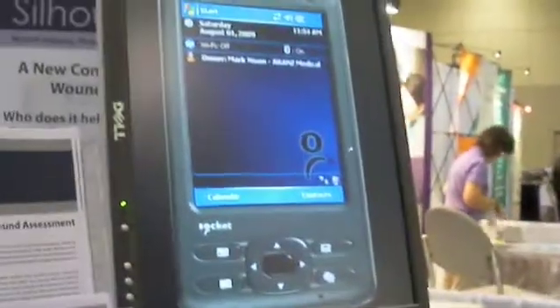Hello, my name is Mark and I'm going to demonstrate to you the Silhouette Mobile. Silhouette Mobile is a wound imaging and documentation system which creates a 3D model, allowing us to make accurate area and depth measurements. It is based on a PDA platform.